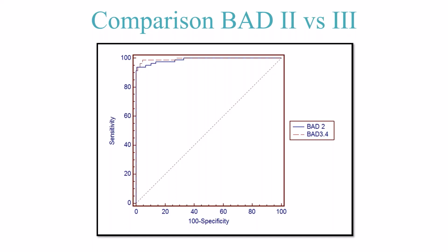And again, this is a comparison of the BAD 2 to the BAD 3. And for those of you who are familiar, once you get up to that 90%, 95%, it's very difficult to get improvement. So this actually is a significant improvement.